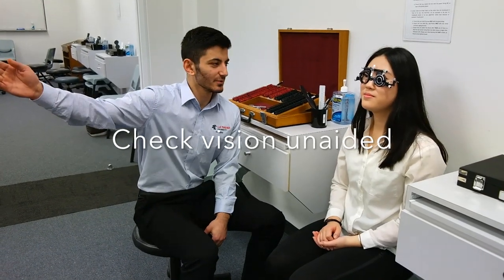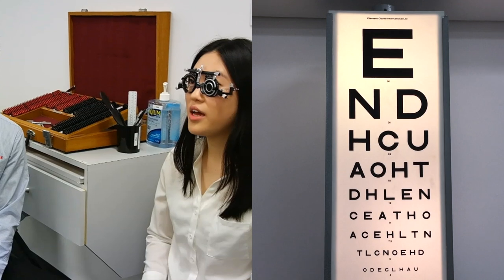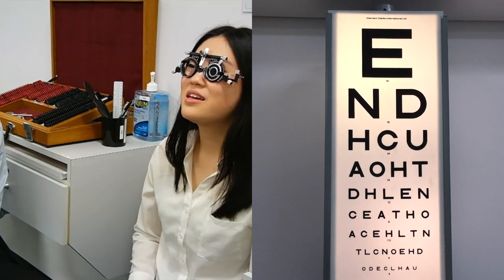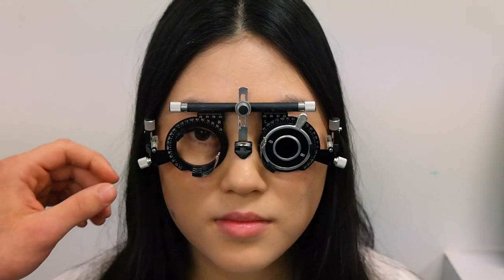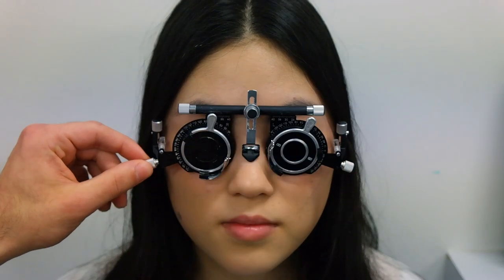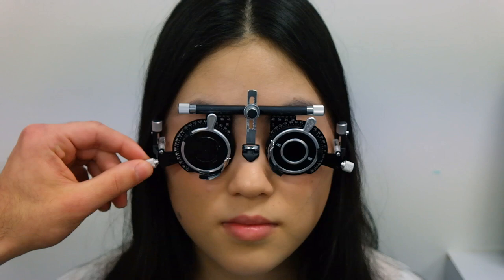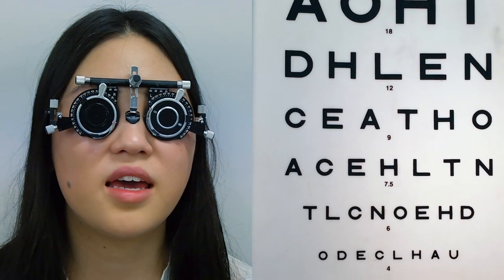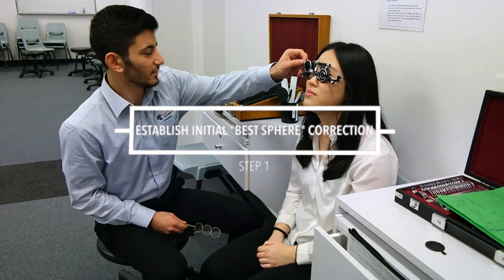With the left eye occluded, the patient is asked to read the lowest line on the chart. The pinhole is then placed in front of the right eye. The pinhole blocks out peripheral rays of light so that the principal ray falls onto the retina, allowing the orthoptist to assess the patient's best corrected acuity. We aim to get the final refraction to match this pinhole result.